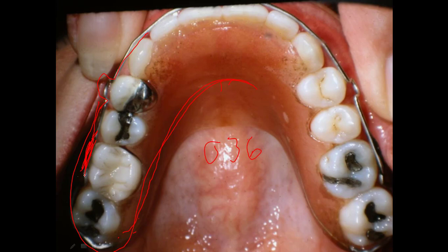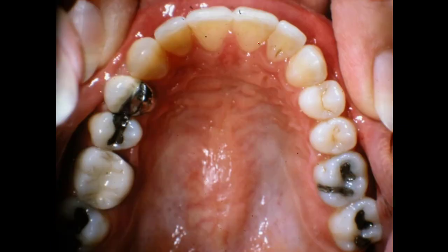And this is a good retainer. It allows the teeth to come together all the time. It has a bite plate that keeps it from deepening any more than that. And if they'll wear this retainer and keep the bottom straightened out, the 3 to 3, the teeth should be that way from now on. So let me see if we got the lower. There's the upper. You see she's wearing it pretty good. And they stay with that. They can, but if they lose it for a week or so and put it back and force wear it, it'll bring the teeth back to place if they've moved out of position.